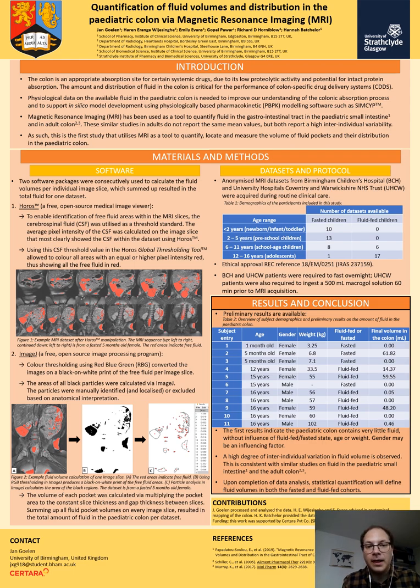in vivo. MRI has been employed before to look for the amount and distribution of fluid pockets in the colon in adults. Here, the average values range from 2 to 13 milliliters of colon fluid in fasted state, but the individual values vary widely between patients. My research aims to use MRI as a tool to quantify these fluid parameters in the pediatric colon based on a similar research previously done in our group for the pediatric small intestine.